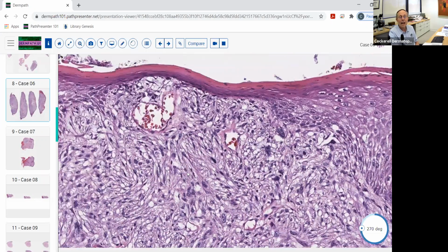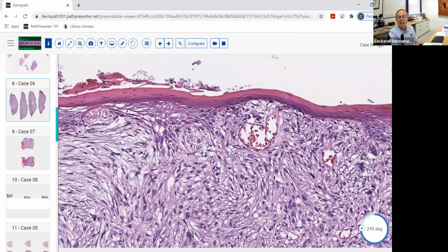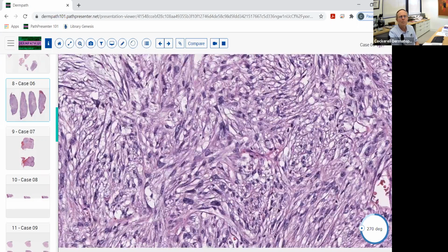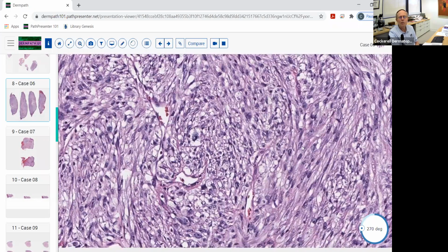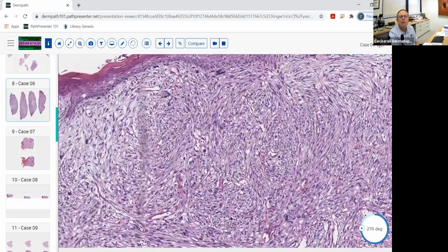And it's very common to see mitotic figures in these lesions. Usually you'll see abundant mitoses, and they usually are really quite atypical. They usually have multipolar, tetrapolar morphologies to them. Some people refer to the mitotic figures as looking like lumps of coal. I don't really see, maybe up here, there might be one of these.